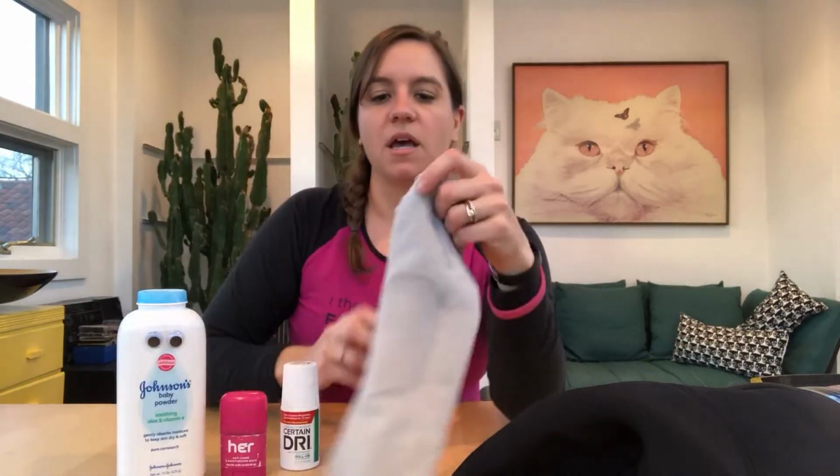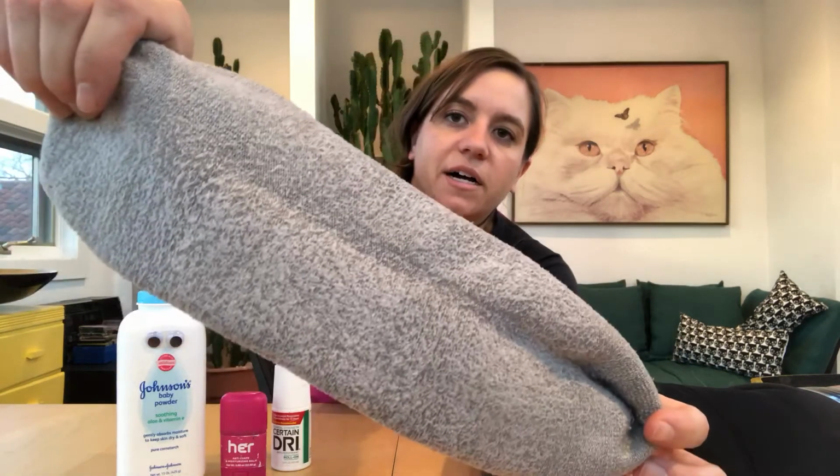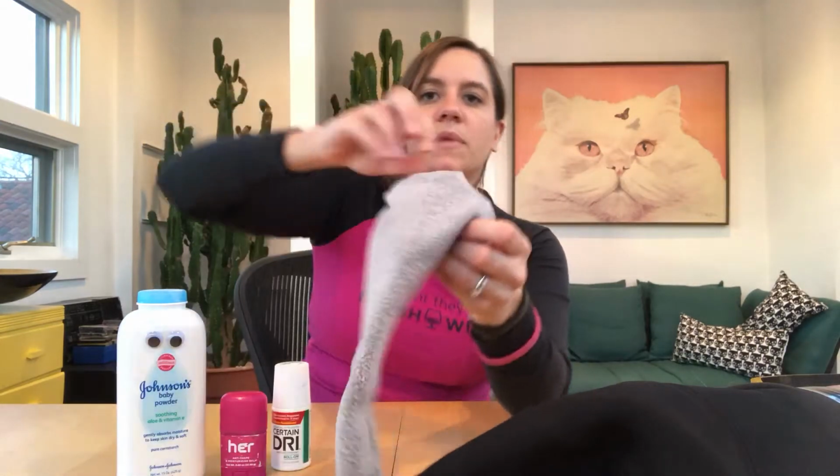For my residual limb that goes in the socket, I wear a gel sock. Many amputees wear gel liners. The gel sock with a foam liner is an old school method, and that's what I've stuck to because that's what I've grown up using and what I'm comfortable with. The gel sock is very soft and filled with gel, so it's squishy, and it absorbs some of the sweat, so I don't get pooling of sweat in my leg like some amputees do. However, I still get chafing from having a wet sock, so the way I've combated that is with baby powder and Body Glide, which is something triathletes know about for putting on your wetsuit and dealing with chafing on different parts of your body. I've found that using the baby powder and the Body Glide with the gel sock is what works for me.